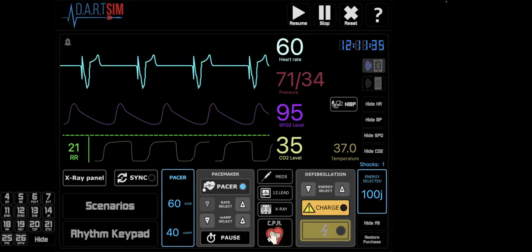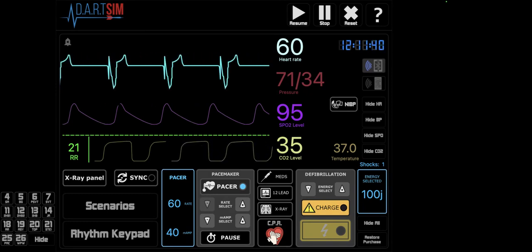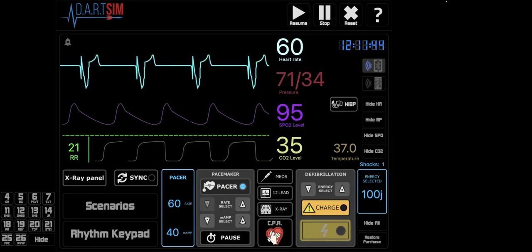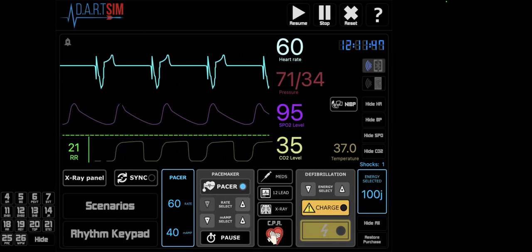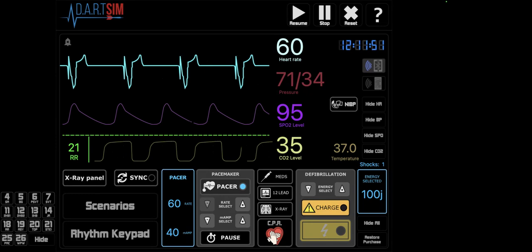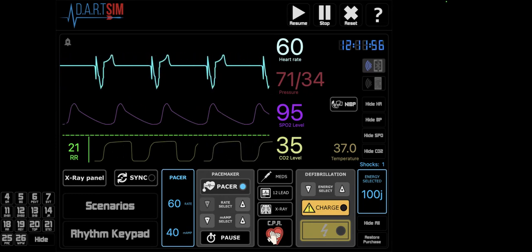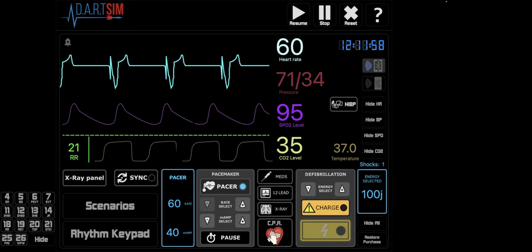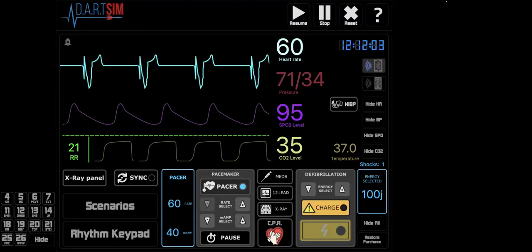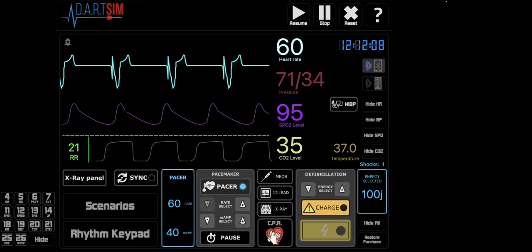Patient still is hypotensive. And sometimes when you pace somebody, you are only pacing their ventricle with this type of pacing. And when you lose the atrial contraction, you lose something called atrial kick. We talked about atrial kick on Tuesday of our BCMI course, and we said that atrial kick was that last little bit of cardiac output that occurred from active atrial contraction.